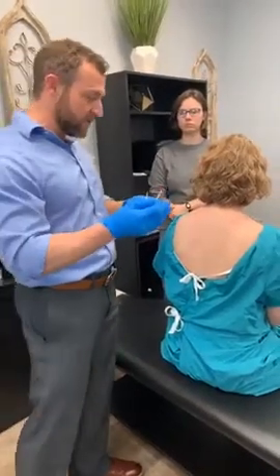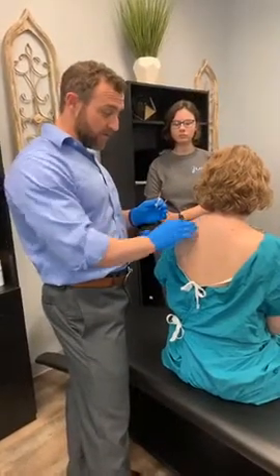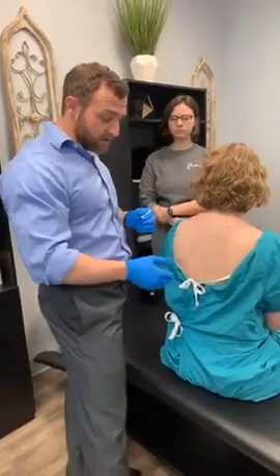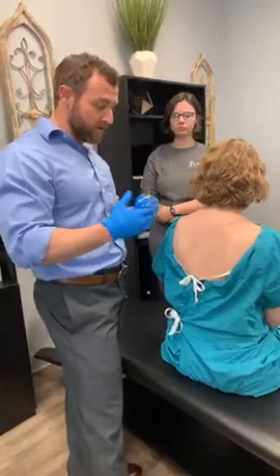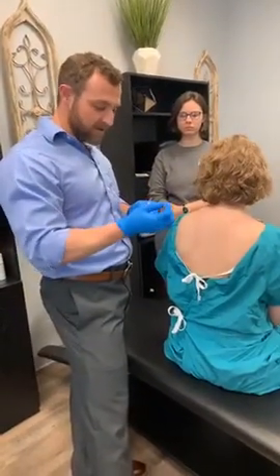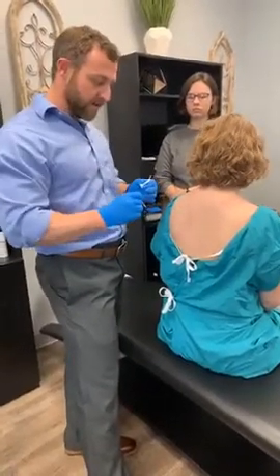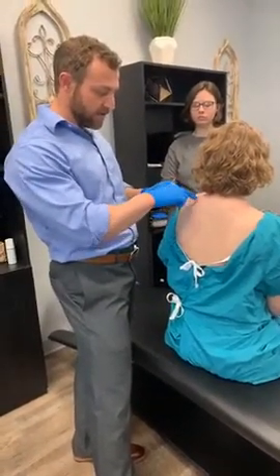There are different gauges of acupuncture needles that we use depending on the area that we're needling. If we're doing work in the hips or the lower back, or an area where there's thicker tissue, then we'll use a longer needle. But this is a fairly thin, relatively short needle, and we don't have to take these very deep. We just take it right into the muscular knot.